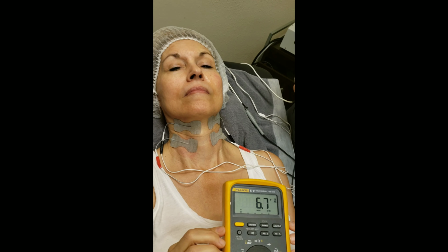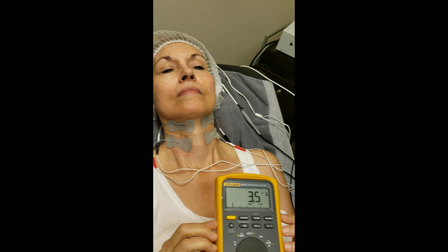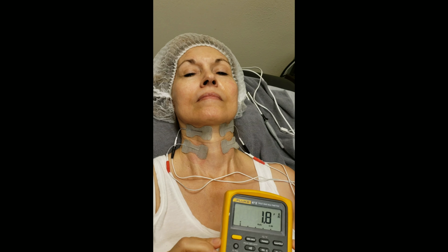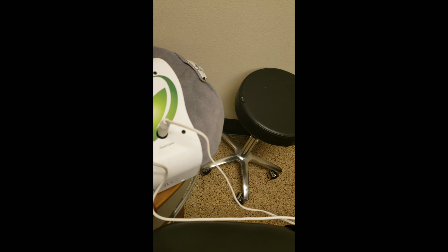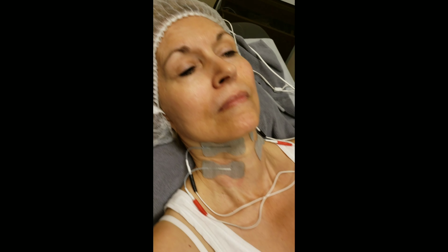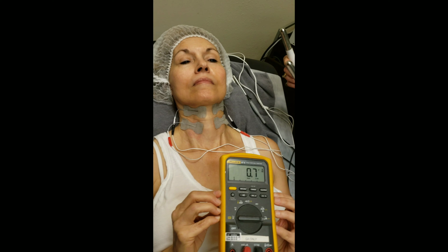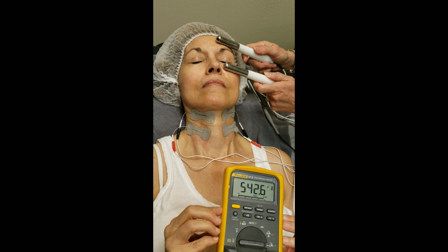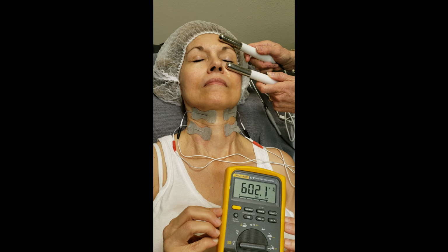So let's try something different. If we were to change the program, you could see that we can try Pico, and we may even get a different level with that based on the Pico program. So we're going to try that. So see what you get on that. Each particular program requires different levels in order to be efficacious for that particular program.